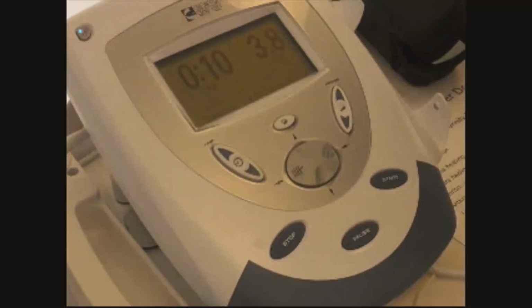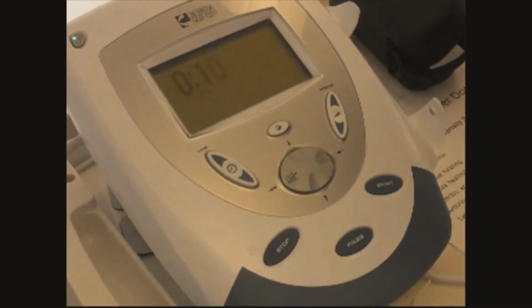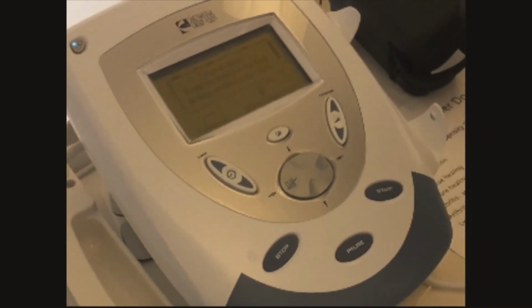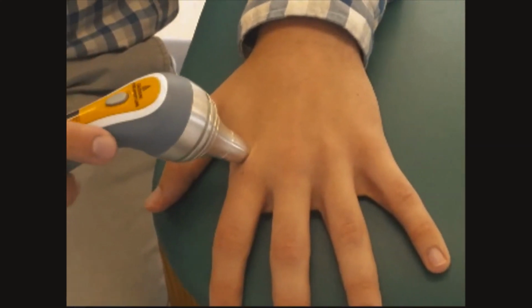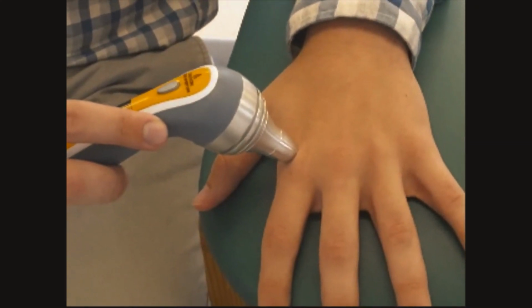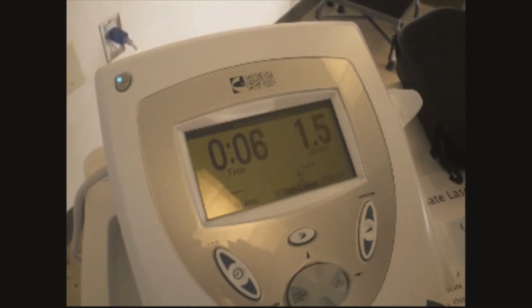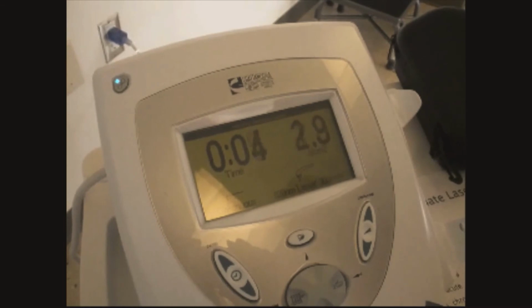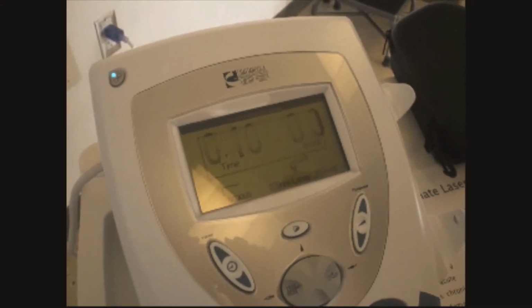So now that you've set your parameters, you can go ahead and start treatment by pressing the start button. When you're applying the laser, you want to do it directly over the skin with firm pressure perpendicular to the surface. And once you've gotten your position, you can go ahead and press the button on top, and the laser is now working. If it's over a painful joint or wound, keep it just above the skin surface. And if it's over a large area, you can apply it to the adjacent area about 1 inch away from the prior treatment region. And you can do this pulsed or continuous.